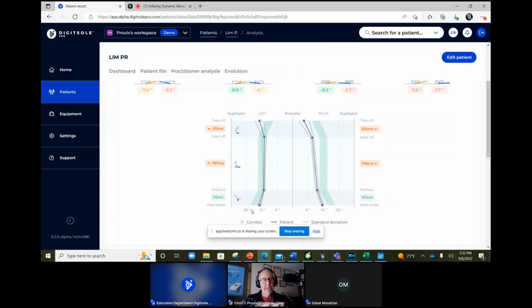And then what we see in the forefoot is we do start to see some pronation in the forefoot. But you still see, and people will ask, well, I'm not at a zero angle. You're not, because again, we're looking at the foot as a rigid foot model as it's coming in contact with the ground. And as we go into the heel off position, typically the foot may move into even less of a heel inverted position and may actually go into a heel everted position. So some people do go into a positive angle into that heel eversion.